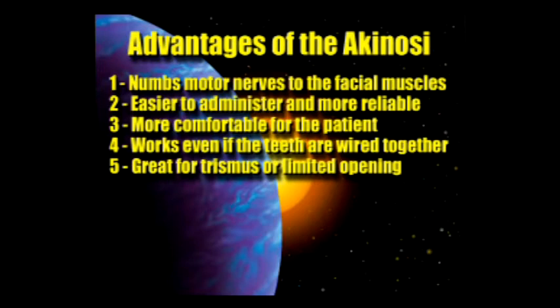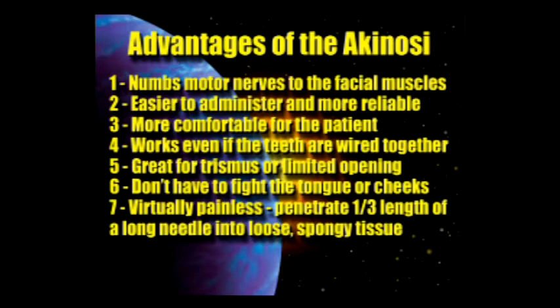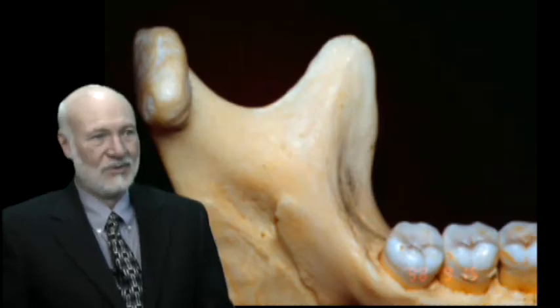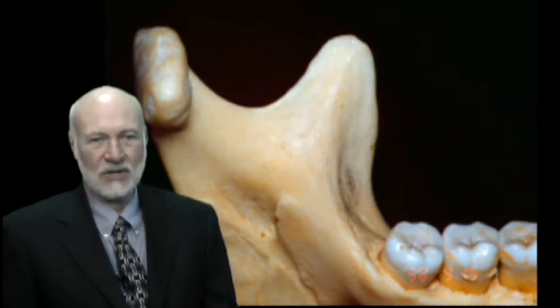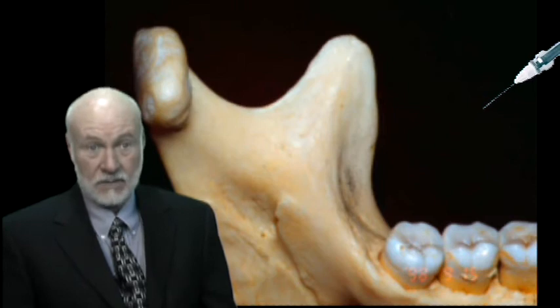It's great for patients who have trismus or limited opening. You don't have to fight the tongue and the cheeks all the time with the teeth together. It's virtually painless because you only have to penetrate approximately 1/3 the length of a long needle into loose, spongy tissue. And finally, it numbs the accessory nerves, the lingual nerve and the long buccal nerve. With the Akinosi injection, you're going to get the nerves before they branch off: the lingual nerve and the long buccal nerve.